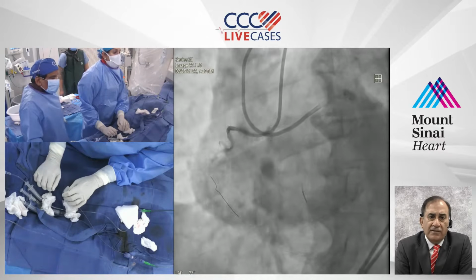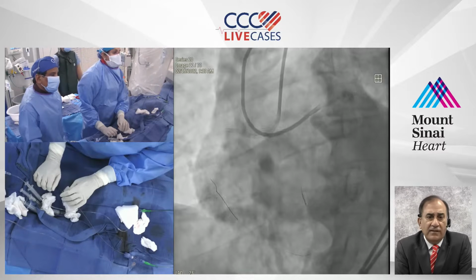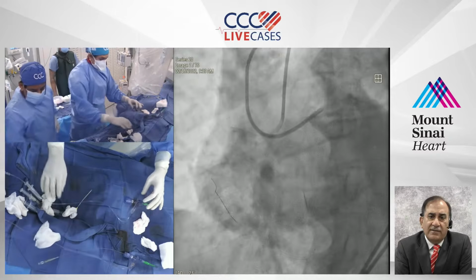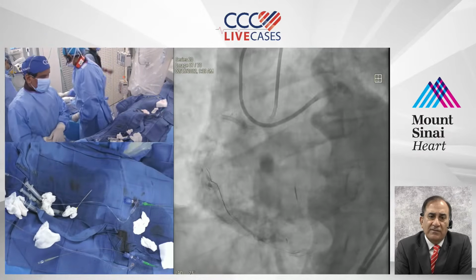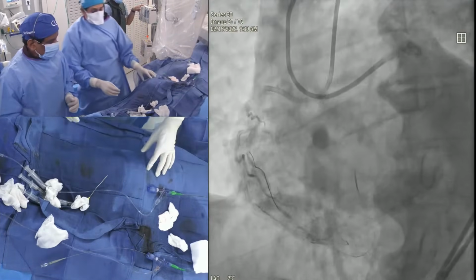Doesn't the wire there look to be in a? Do you move the antegrade? You want to try antegrade a little bit quickly? Yeah, it's looking good. Get things ready with the Fine Cross. Looks like what you were wanting to achieve in three months may have occurred there. Okay, we'll try gently.